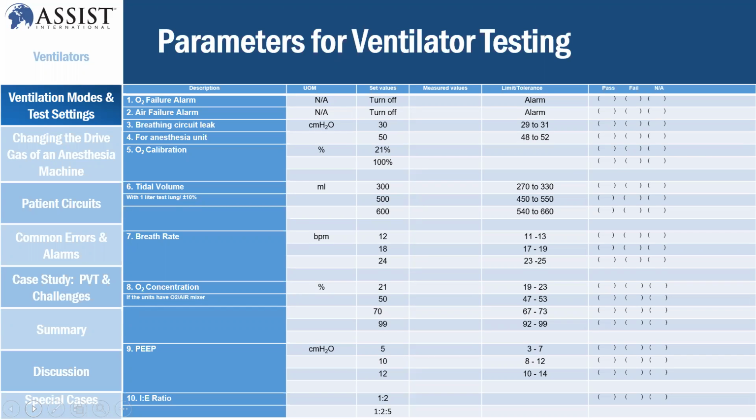And when you do ventilator testing, make sure that you do self-test verification.